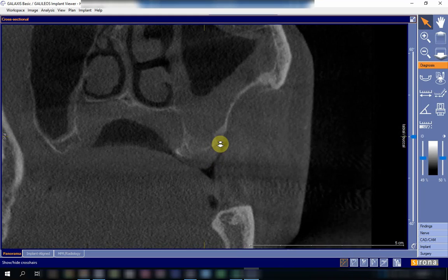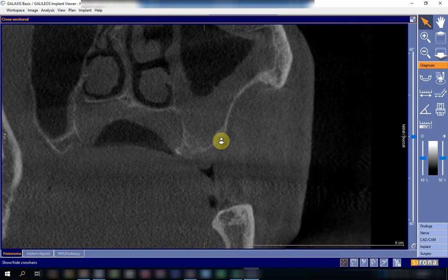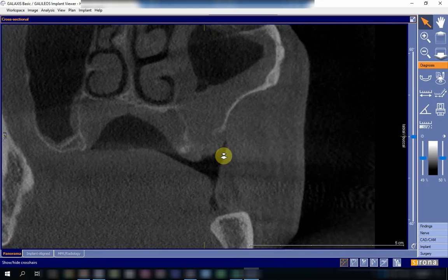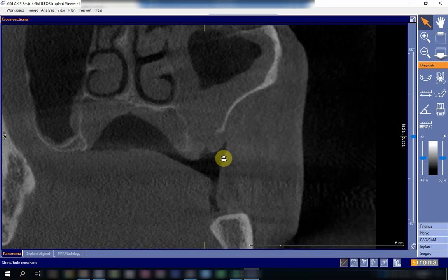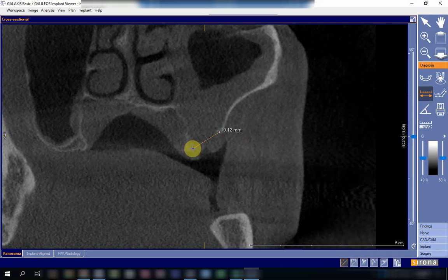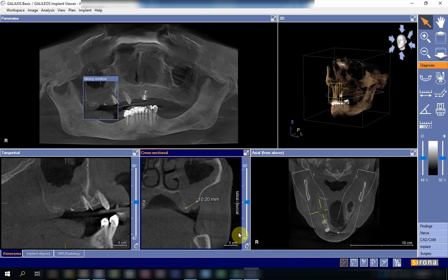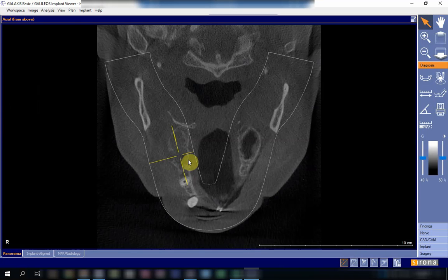Going more posteriorly, the sinus floor starts to develop again. Going anteriorly, the area of discontinuity in the sinus floor is around 10 millimeters in the buccolingual direction.